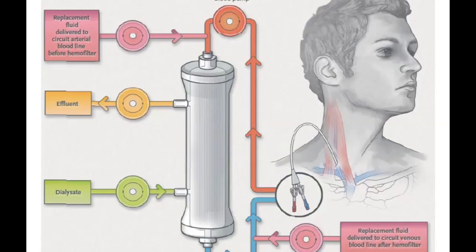Just a couple of things to think of, put this in the context of a larger one here. A couple of points here is in typical dialysis, by convention, we have something called an arterial line and a venous line. This stems from the 1940s when systemic blood pressure was actually used. Surgeons would do a cut down line, place a catheter in the femoral artery and another catheter in the femoral vein, and so the patient's own blood pressure would pump the blood up to the cartridge and provide the pressure in the machine. In modern days, obviously, as you know, we have a single dialysis catheter.